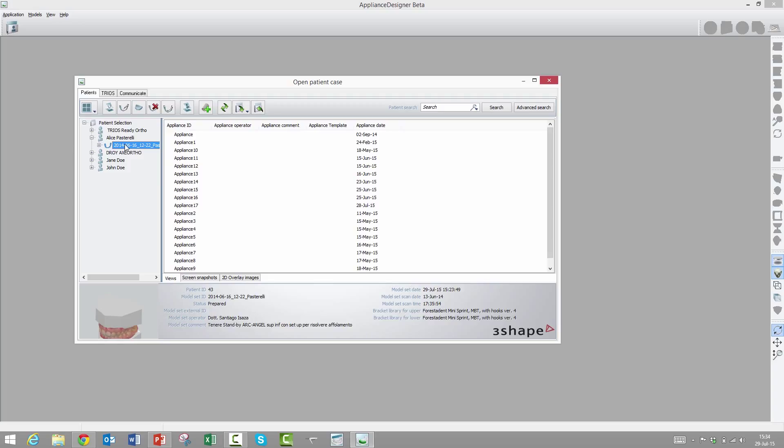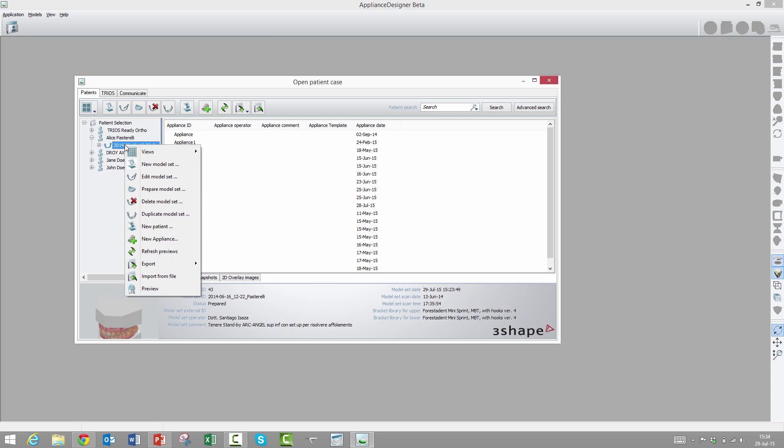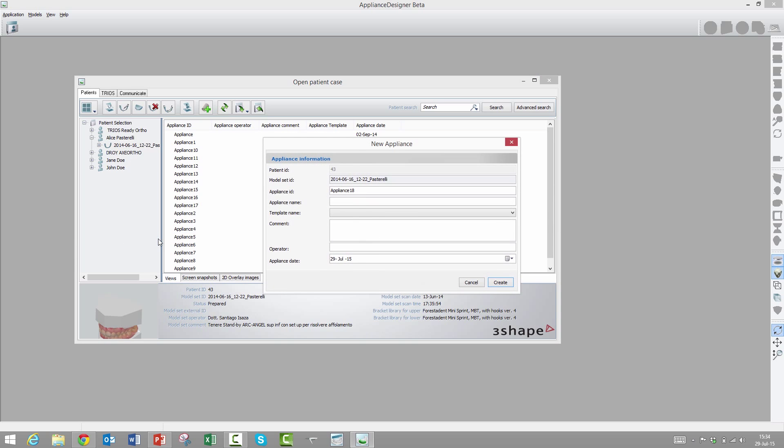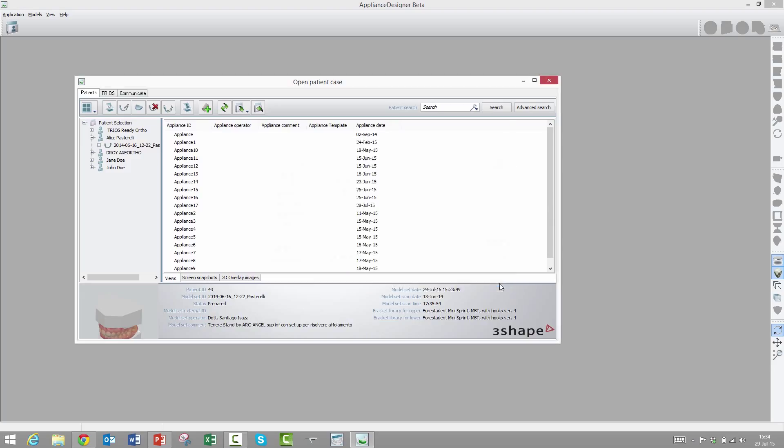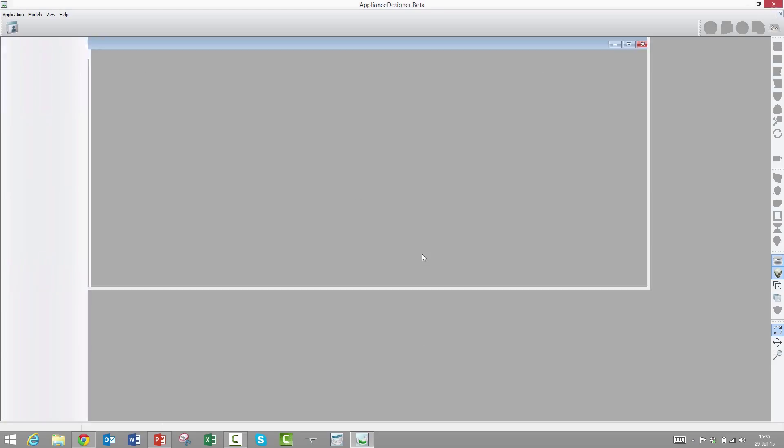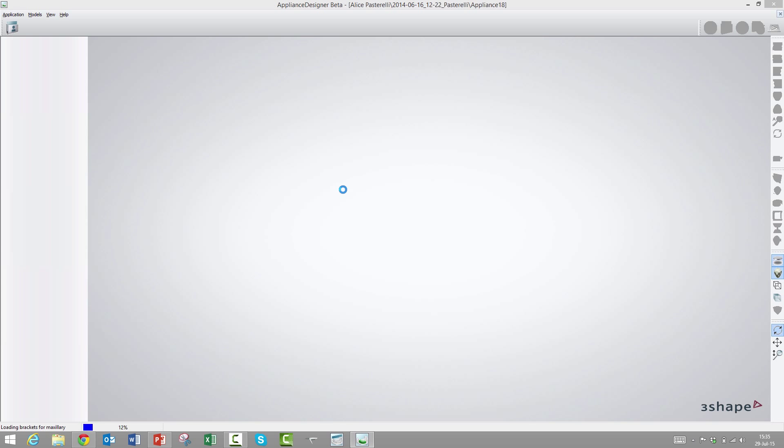We are now in Appliance Designer. For those who watched the first video on bracket placement, that was in Ortho Analyzer. Once that case was validated, the actual bracket transfer happens in Appliance Designer. This is a validated case. We will right-click on it and choose to make a new appliance.